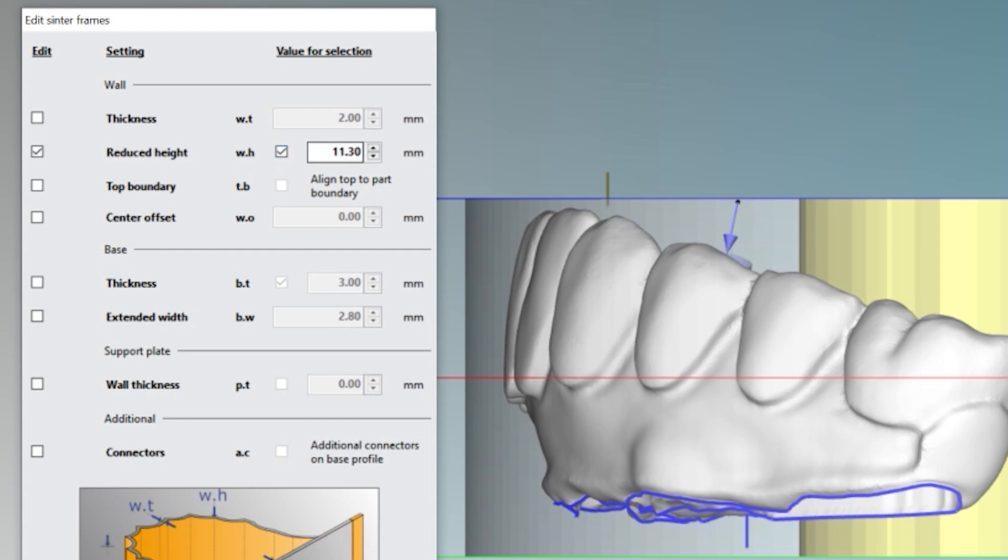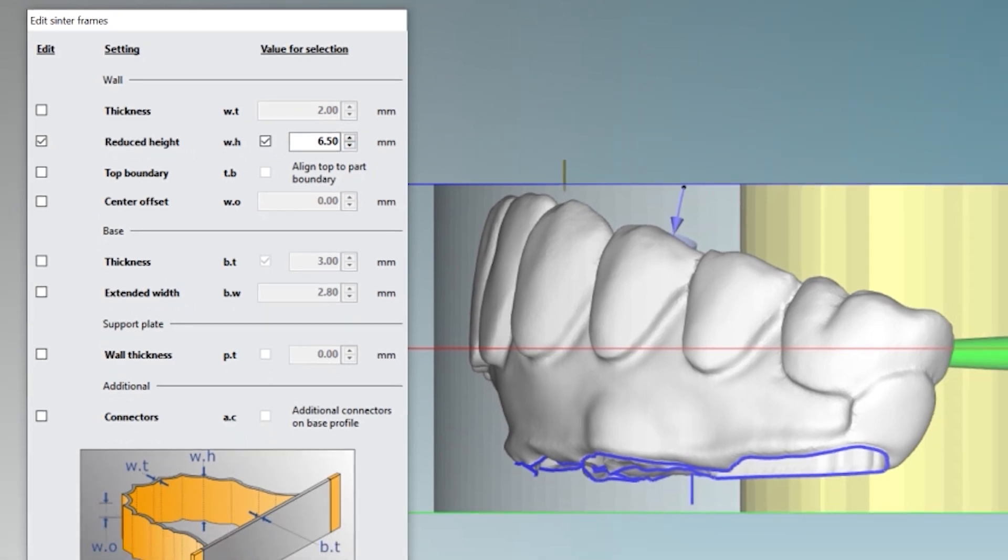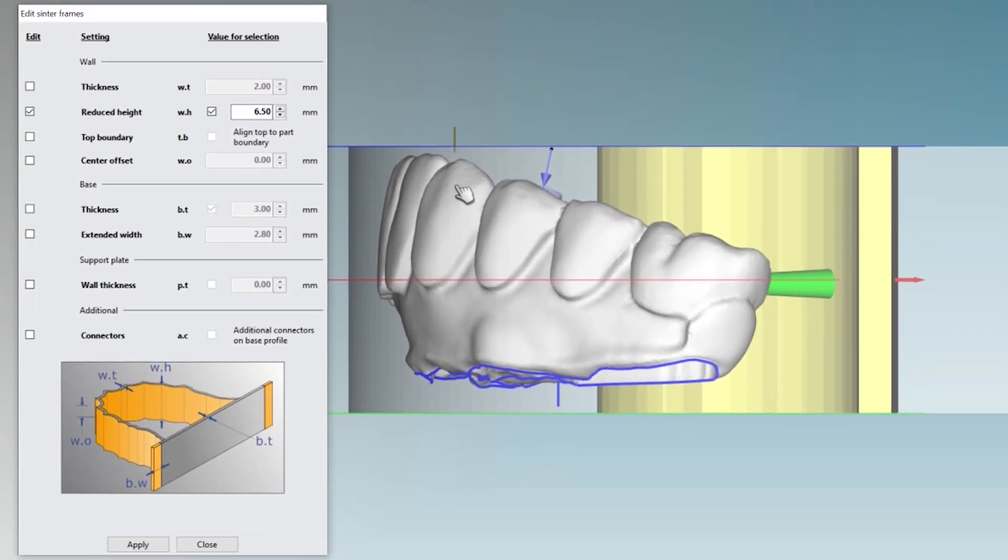Right now it's at 11.30 millimeters. I want to reduce that. Let's start off by reducing it down to 6.5 millimeters. All right. Now you see right now, even though we actually adjusted it down to 6.5 millimeters, nothing's happened. All right. To activate that, come down to the bottom, hit apply.